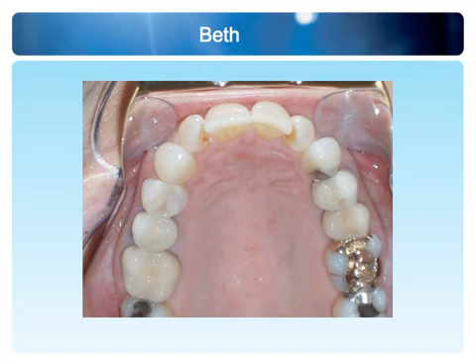And on top of that, we have great opportunity to do IPR, because we have restorations back here. So we could do wonderful IPR on some of these posterior restorations. Guide these teeth wider, draw that canine back and unravel the laterals. And that's one way to do it.